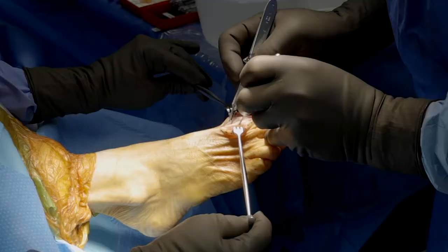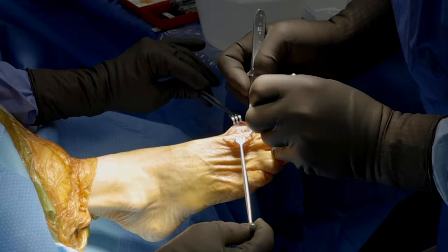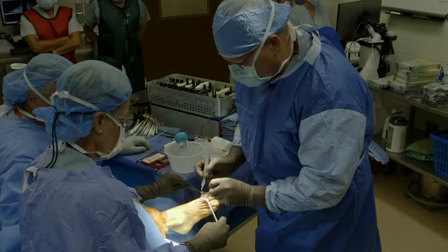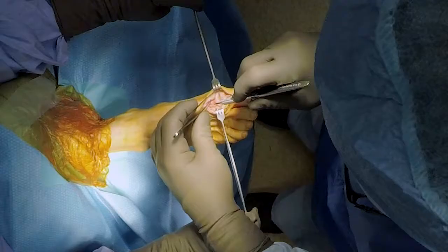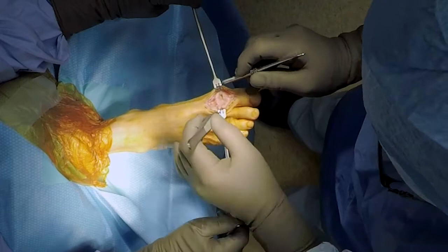I like to do this — I think of it as an upside down knee replacement, where the patella actually sits on the bottom. The reason I like to do that is because I take the whole thing down as a sleeve, literally staying right on the bone so that I can pull the whole thing down as one sleeve.